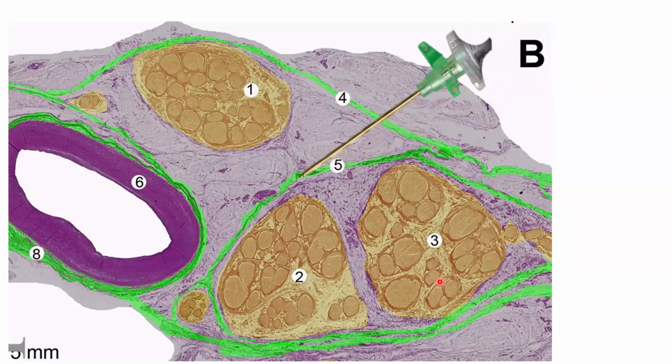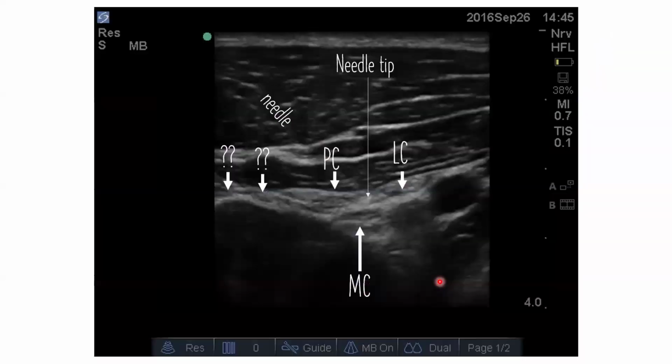So this is the way that the needle has advanced through the circumneurium or the paraneural sheath. One of the ways to target is to target the entire paraneural sheath. So follow this paraneural sheath or the circumneural sheath to where it ends, and where these two ends meet, it gets more thickened.